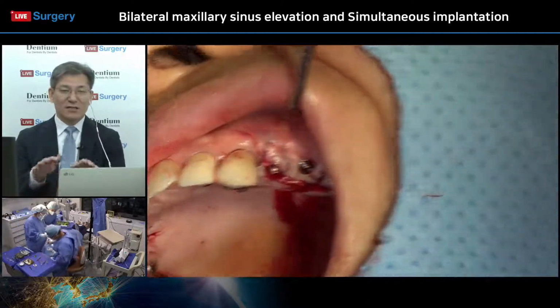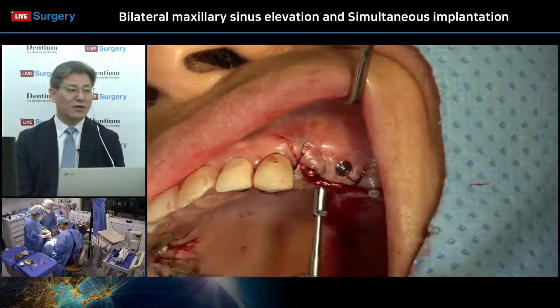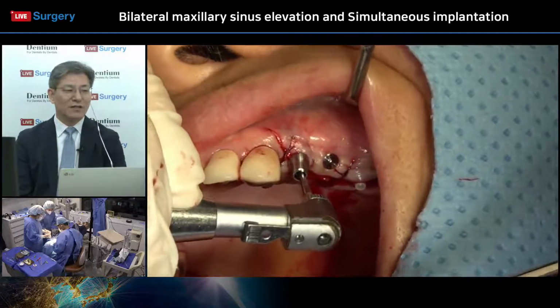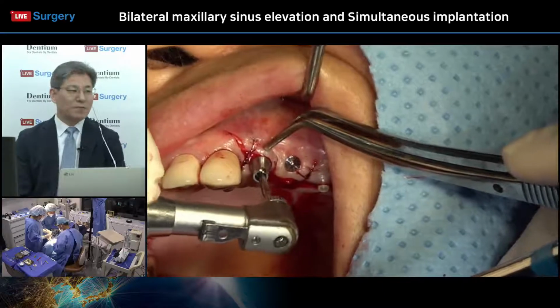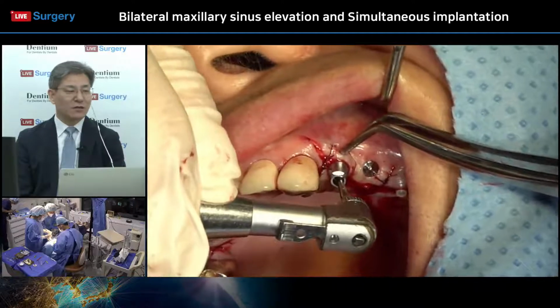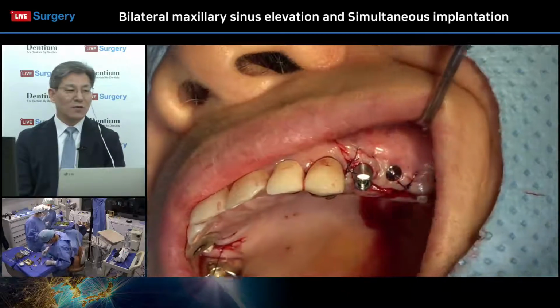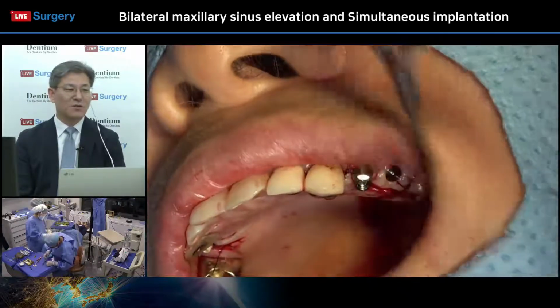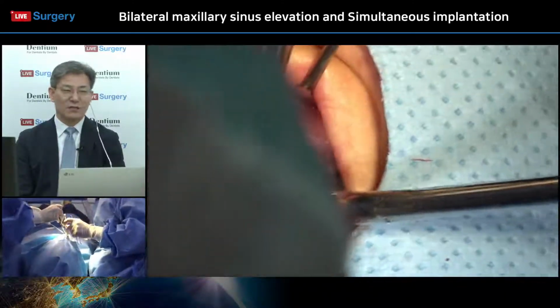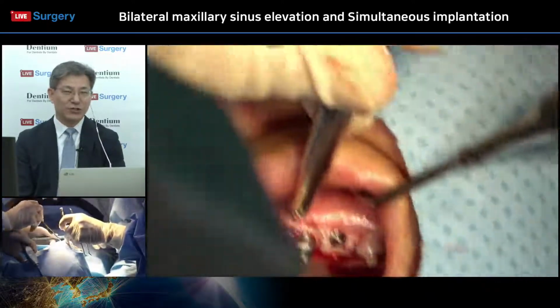This Dentium collagen membrane has good properties of tissue integration. So soft tissue healing will happen automatically and can be achieved within about two weeks. As far as I know, it is not the critical part. It is easy to cover by soft tissues because of this collagen membrane's friendly tendency to the soft tissues, right?